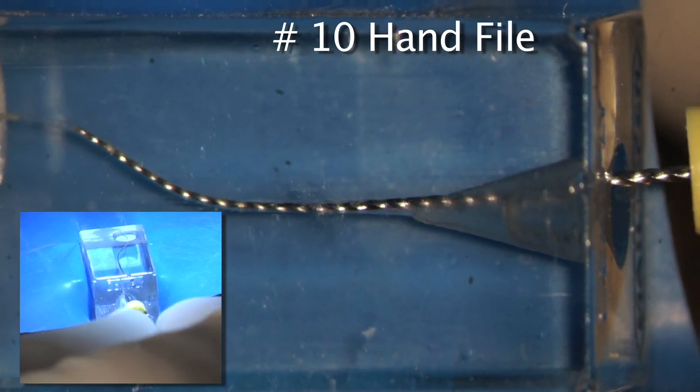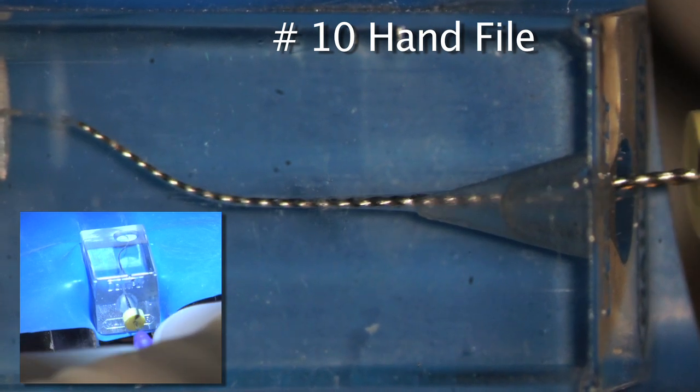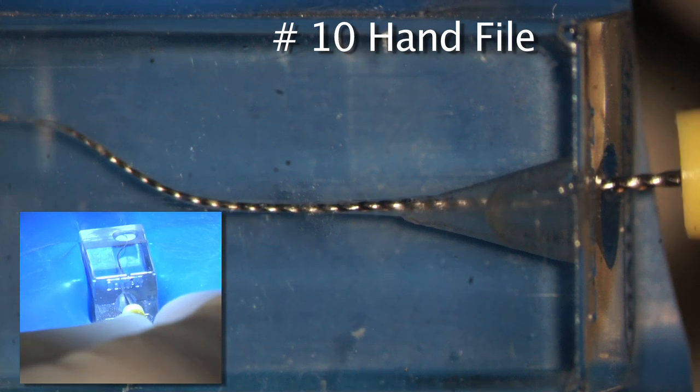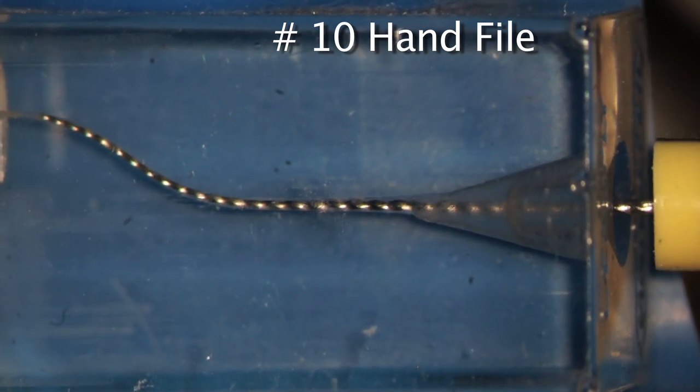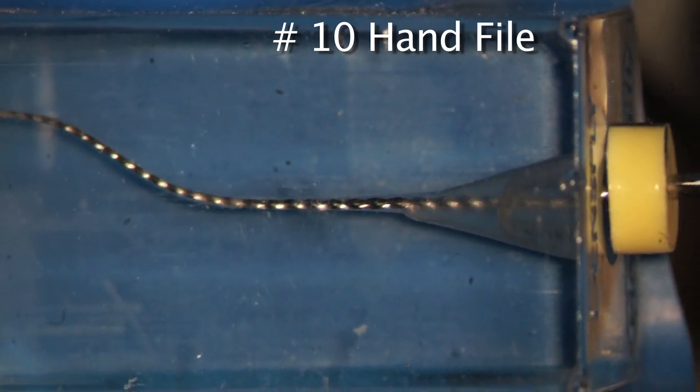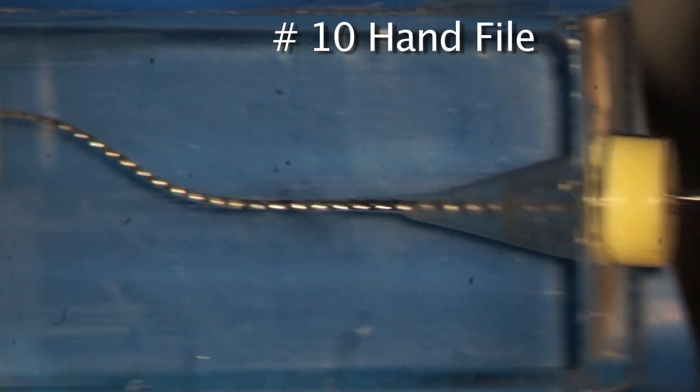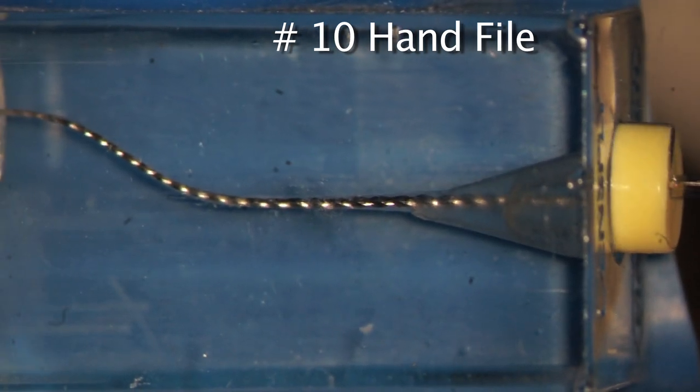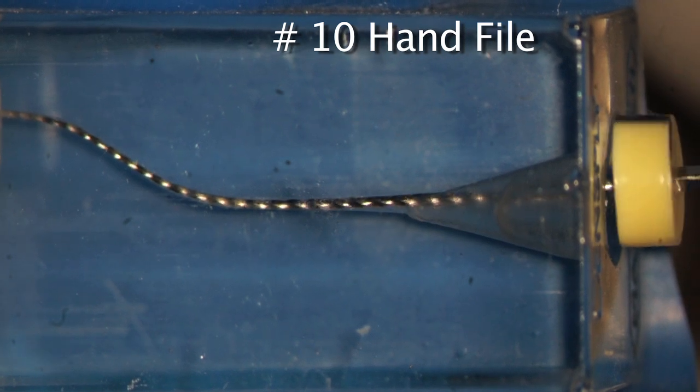We're starting to get a glide path going. In glide path management, you need to have a mechanical method that you're thinking about. You could stop and use the eight if necessary, but as long as the instrument can progress, just take little short strokes, feed it in pull, and we can take a little bit more work, and now the stop's approaching the reference point. So pretty much you can see I'm moving the whole block, which means the file's pretty snug at length. So we have the canal catheterized.